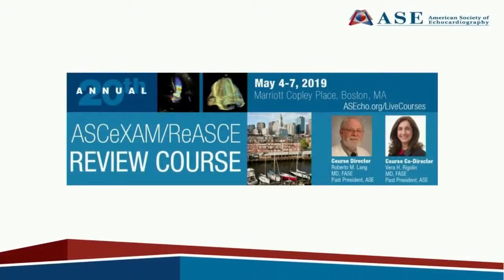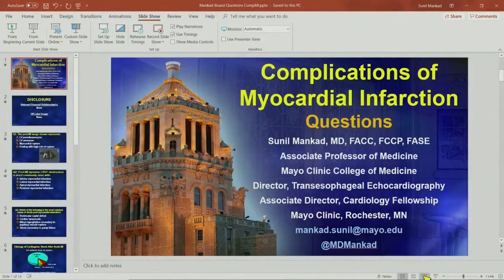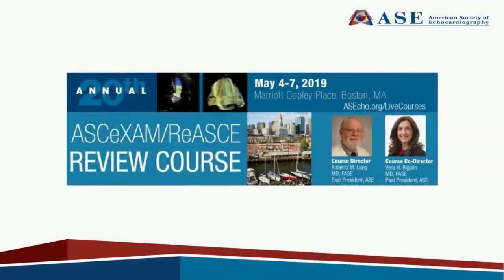Dr. Lang, are there any questions that you think we want to answer? Yeah, please. One will be maybe strange for you, but since we are friends, I can ask you. There are a lot of questions asking why the Mayo Clinic format is different from the rest of the country. And are we missing something? Probably we are, because the Mayo Clinic is the best hospital around, but maybe you can explain.